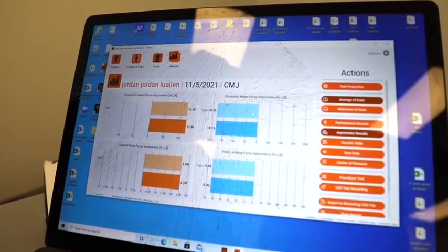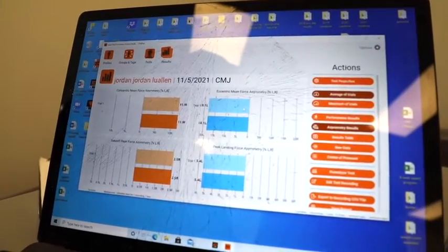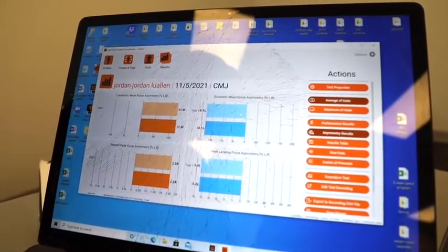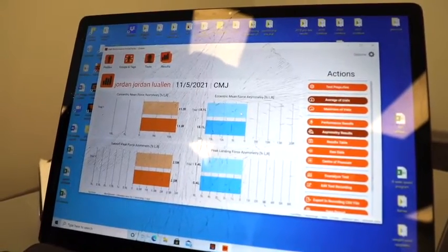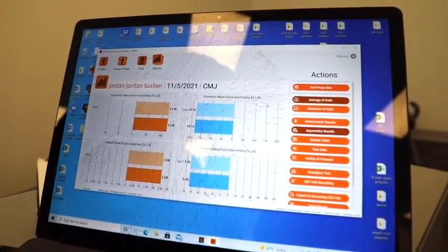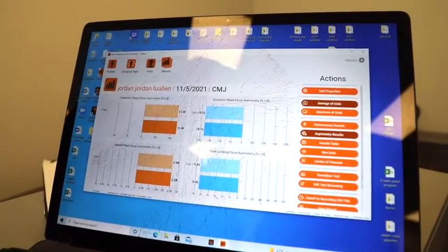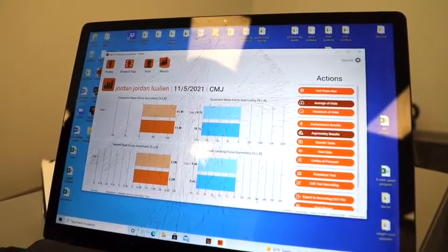And so what this is, from the athlete's static position through their loading phase prior to takeoff, how their body moves. So for this particular result, we've got an 18.1% variation, asymmetry favoring the left side. Now what that tells us is, there's a potential injury that has occurred on the right side that has forced this athlete, as the muscle elongates, to favor their left. So we'll be able to dive deeper into that with the athlete, because we've got a better understanding as to how their body takes off in a dynamic way.